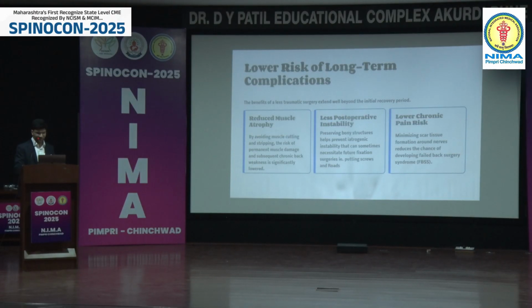The other advantages include, since we are not cutting or separating muscles here, a reduced risk of long-term muscle atrophy. By avoiding muscle cutting and stripping, the risk of permanent damage and subsequent chronic back weakness is significantly lower with endoscopic spine surgery.